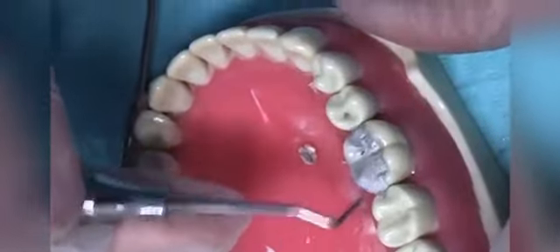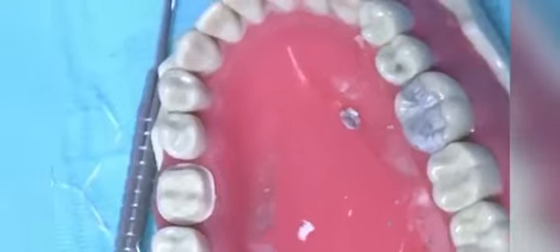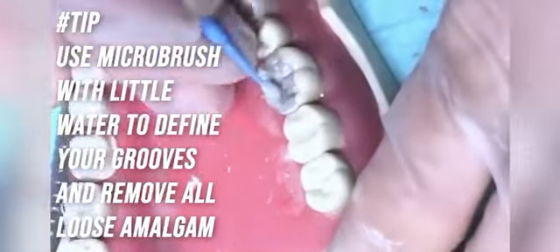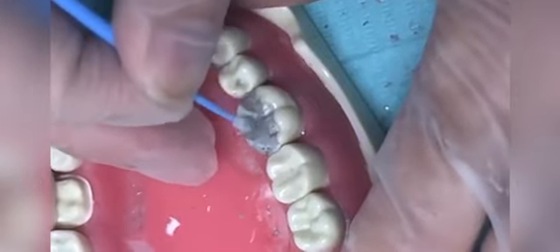And while you are doing the carving, I suggest try to use the cotton roll in between. It will give very good shine and polish. Here in the end, I am using the applicator tip, but you can use it in between while you are doing the tooth carving also.